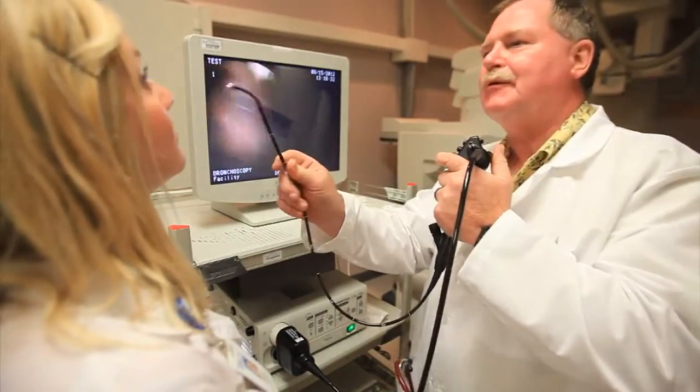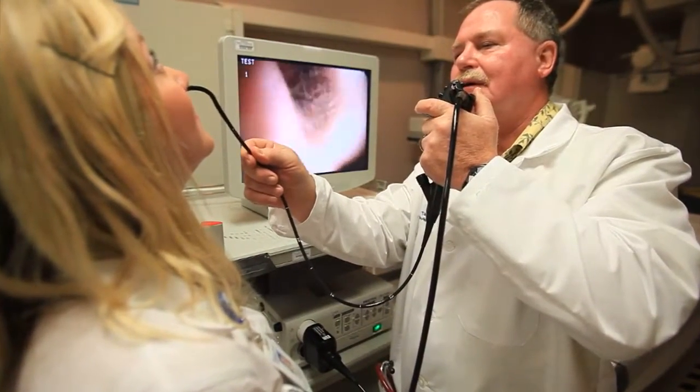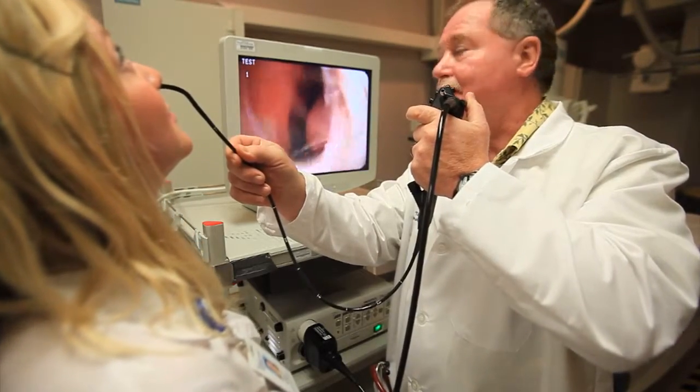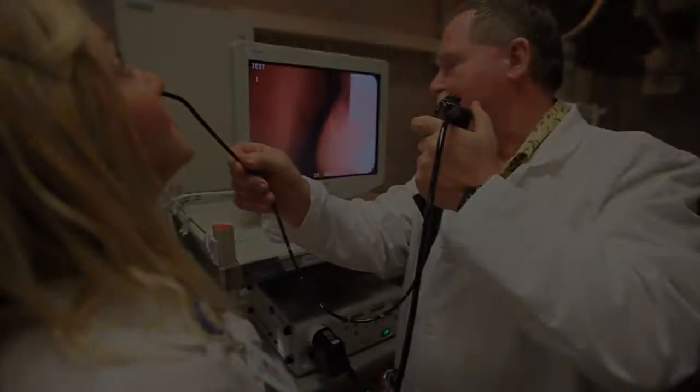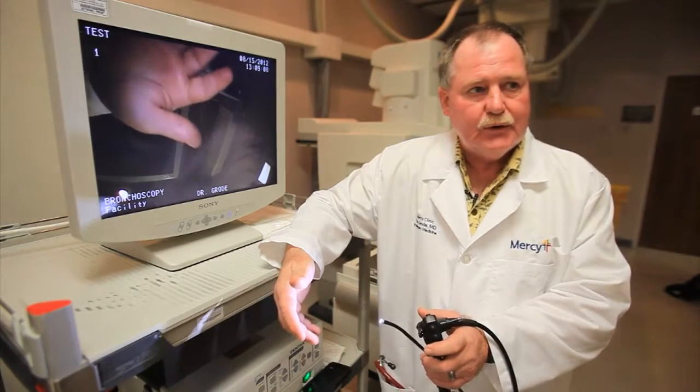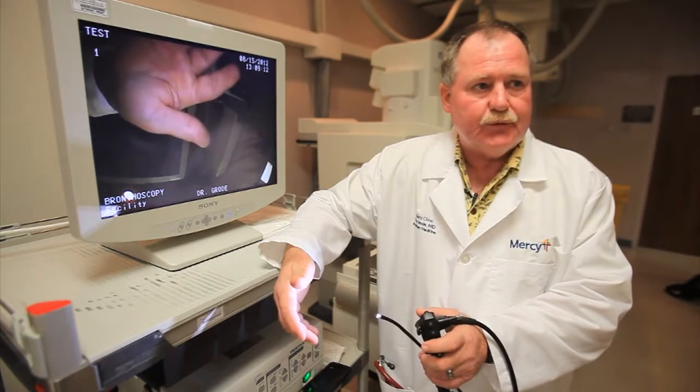Once the patient is asleep, the very small tube is passed through the nose. The nose is treated first with a jelly that'll anesthetize or numb it, as well as the throat, trying to block the cough. The nose acts really as a guide for the tube.